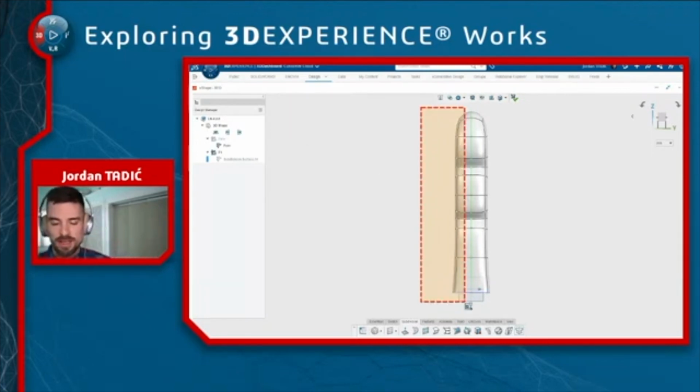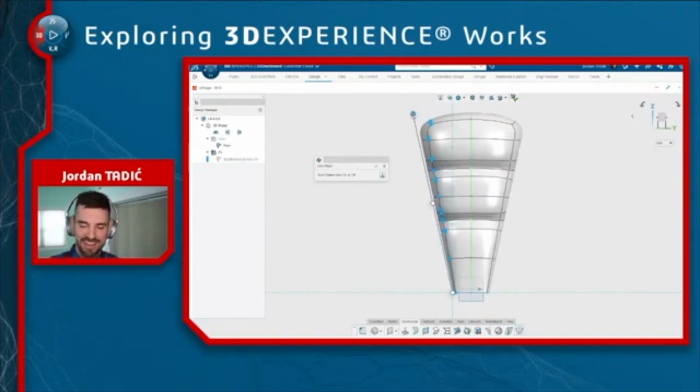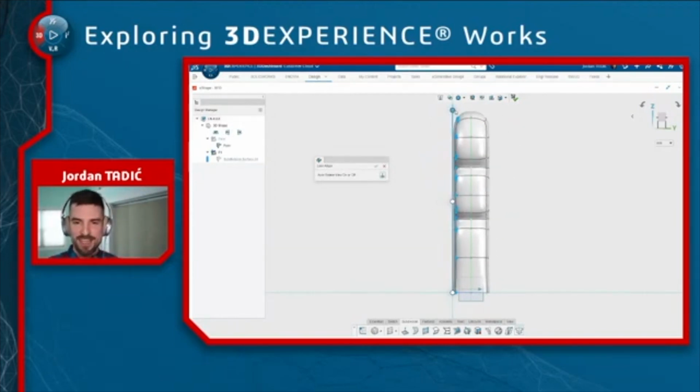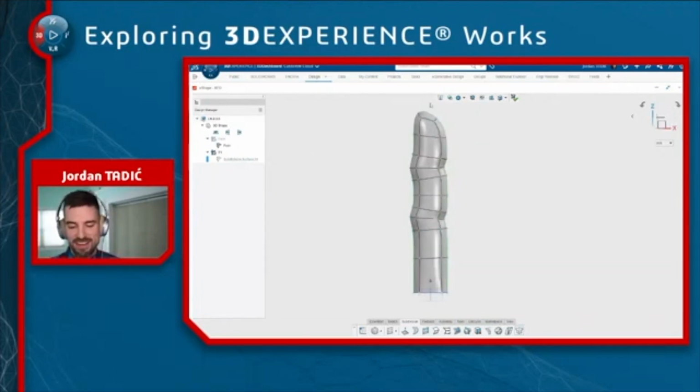So we'll see that better here with this particular example, where what I want to do is I just want to taper the finger inwards a little bit, because obviously the finger starts off thicker at the base and then gets narrower towards the top. And I think that's a detail we were missing out on. So if I align by line with the side profile, I can then, it kind of looks like Yosemite Sam just got his thumb smashed by something that was swelling up. We could taper it inwards. That's the look that we're going for. And get what we're looking for.